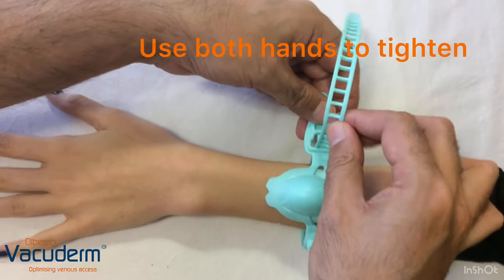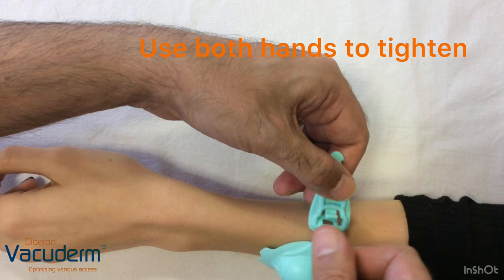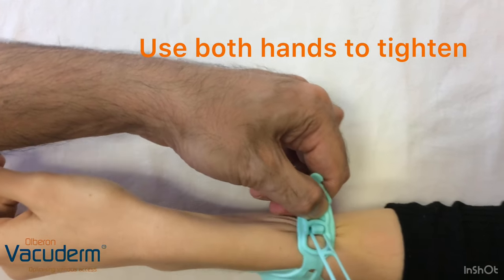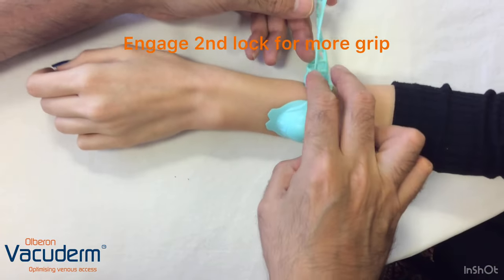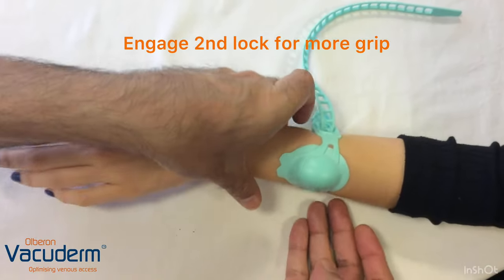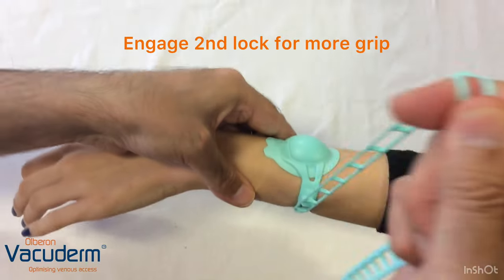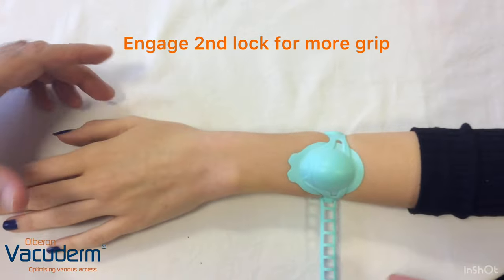To use the tourniquet effect, it has a buckle and a strap. You thread the strap through the buckle, and by pulling the strap onto the buckle and latching it, you get an initial tourniquet effect. You can add to that with the second locking mechanism by pulling the strap onto this buckle, which gives further tightening and grip.